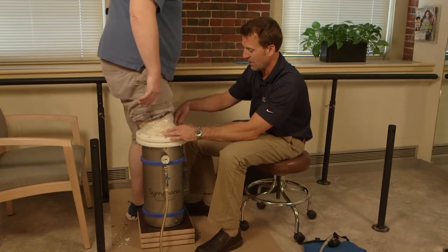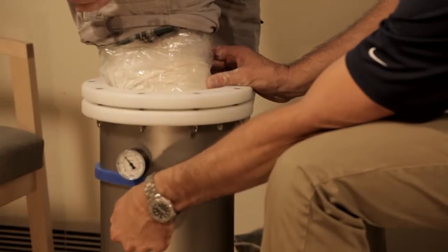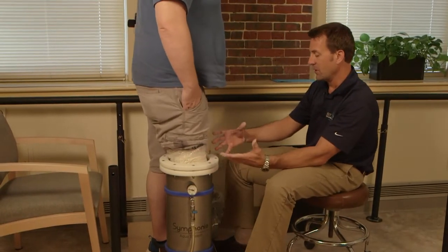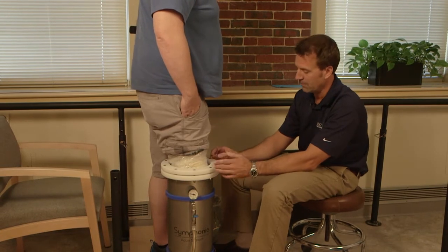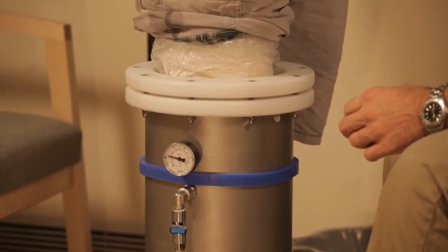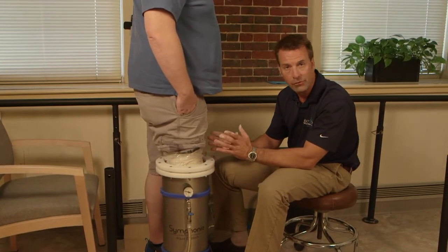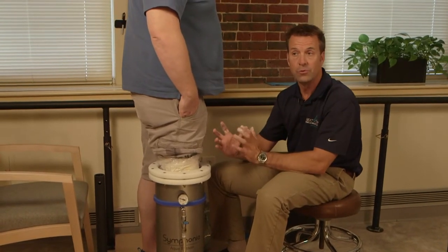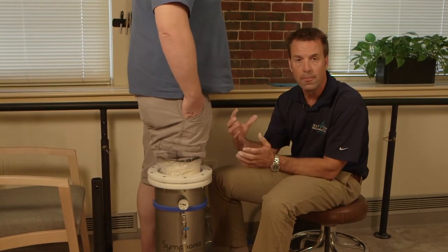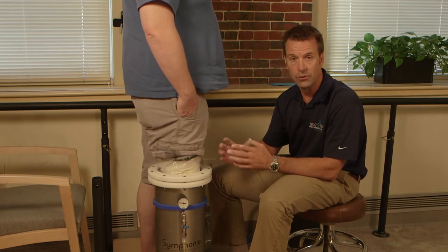I'm going to have him put as much weight as possible on his limb while he's standing here. I'm going to drop you down just a little bit more until your hips are right around even. Would you say you're feeling a nice snug overall pressure? Yes. Is there any pain involved? No, it feels good. Now you've worn a prosthesis before — does it feel like you're standing in a socket? Very similar. And that is the difference. Normally when we're casting somebody, they've stayed seated and we've applied hand pressure to the appropriate areas to design the socket. In this case, the water is doing all the work. It can create a far more global pressure than we are able to with our hands, and that's what makes this unique and what makes the results so beneficial to designing the actual prosthesis.